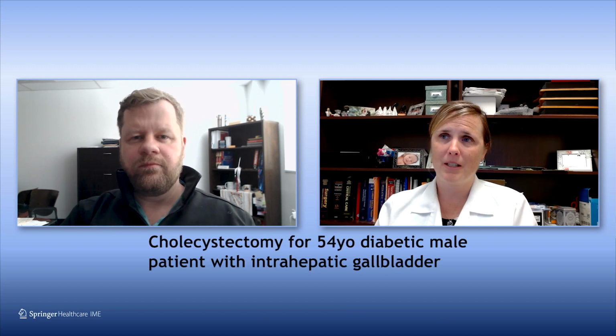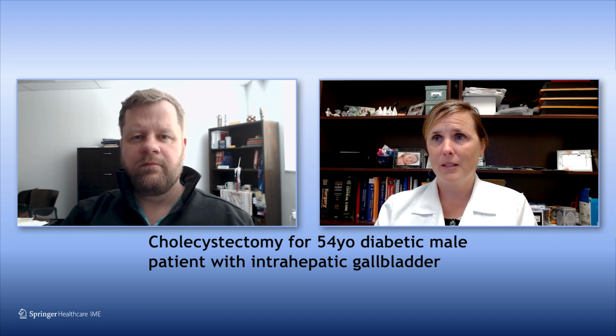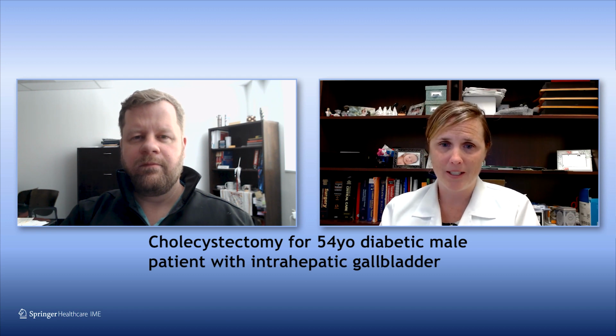For sure. Well, I am going to start off with one that you already sort of started to pitch to us, and that's that terrible gallbladder. Because as acute care surgeons, and especially in the ambulatory setting, this is the money shot. So I'm going to present a 54-year-old diabetic male who you take for a cholecystectomy for symptomatic cholelithiasis. Intraoperatively, he's found to have quite an intrahepatic gallbladder that's thickened and fibrotic.